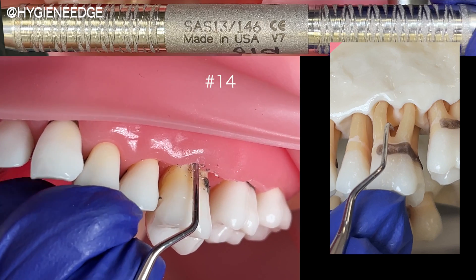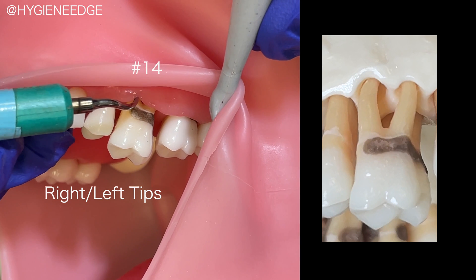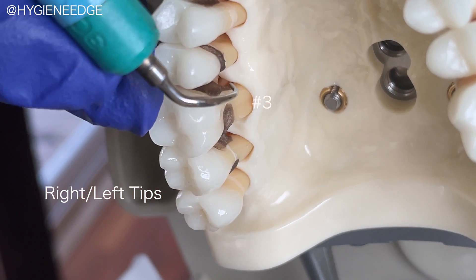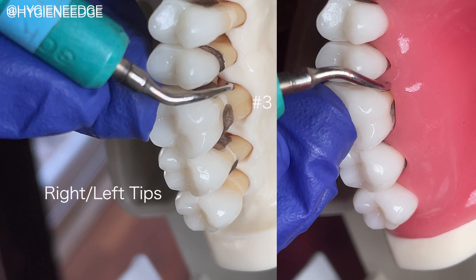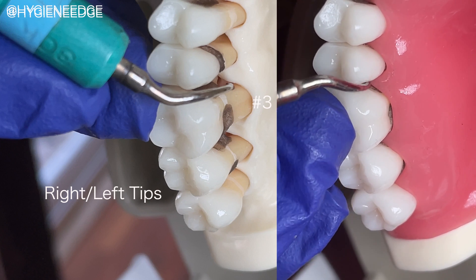When you use power scalers in this area, start at the top of the deposit and channel down to the base of the pocket with the right or left tip. These specific tips allow you to access deep into the pocket and furcations without hitting the curvature of the tooth that's supragingival. This makes adaptation in this challenging area easier. Instrumentation is an art and an advanced skill that you can hone in on with a typodont.